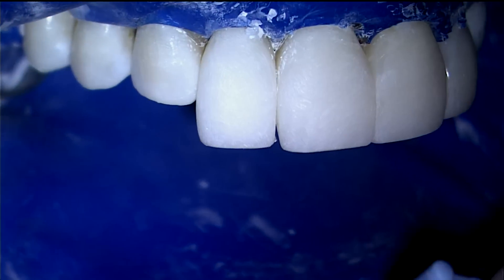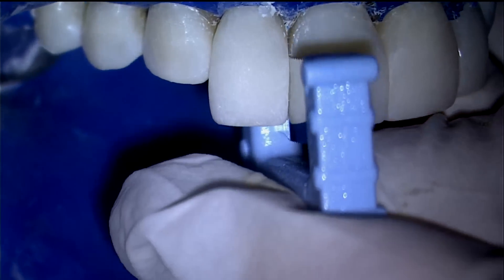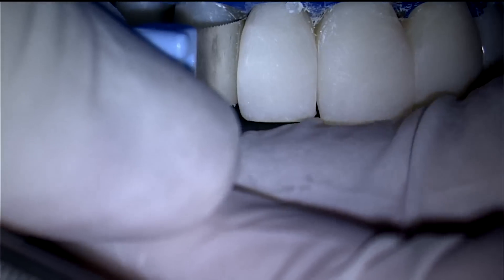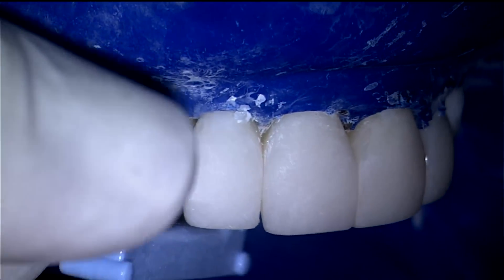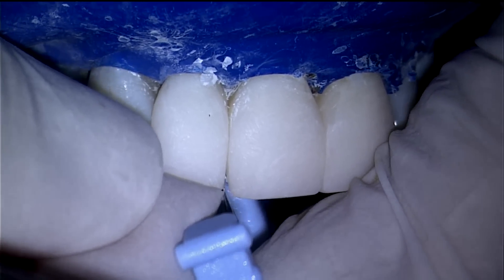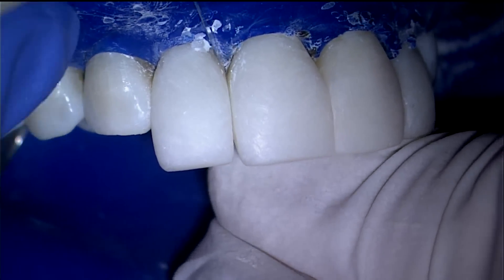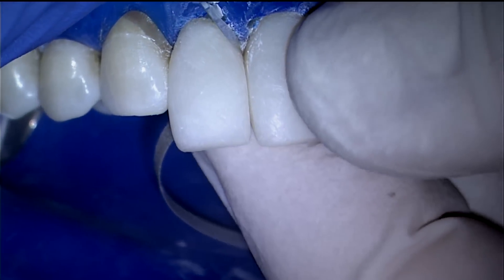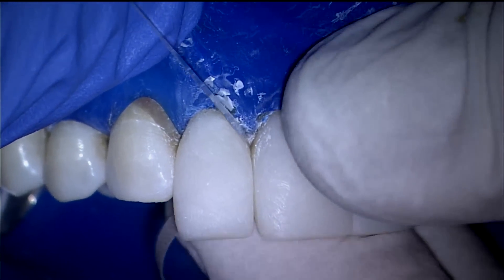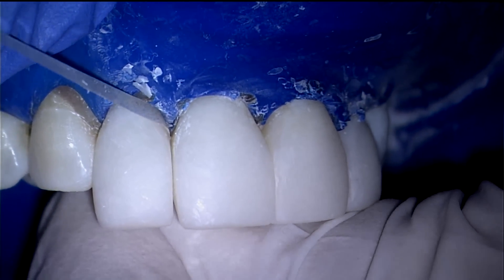The TrueContact SafeSide saw removes unwanted tags of resin and assures a true and solid contact. Use narrow composite strips — the coarse side and then the fine side — to smooth the gingival margins. BioClear's unique fit allows you to do very little sanding of these margins.